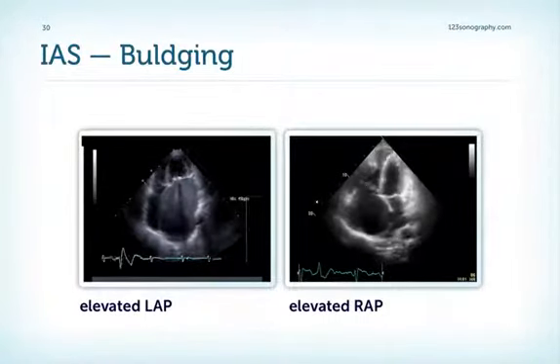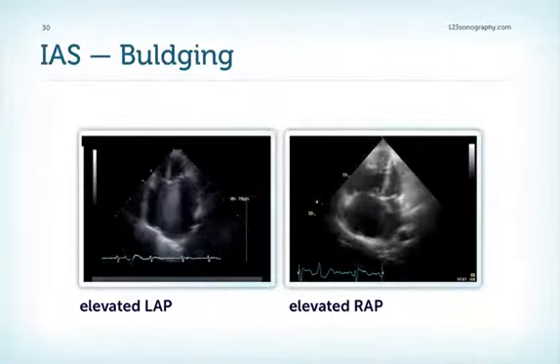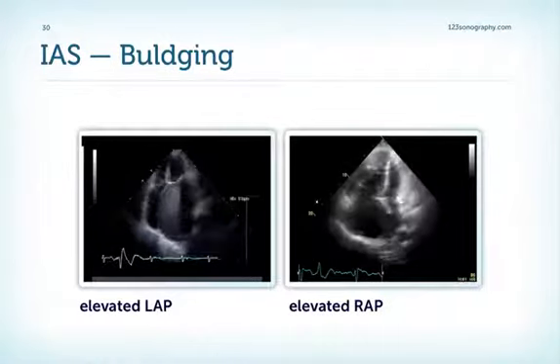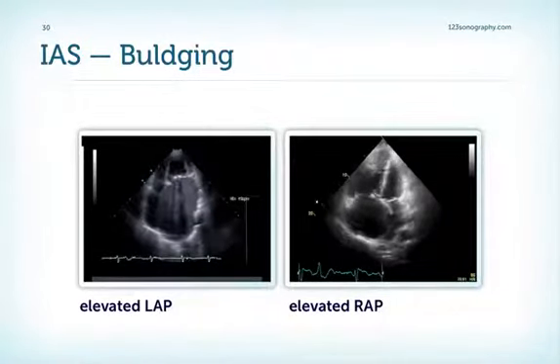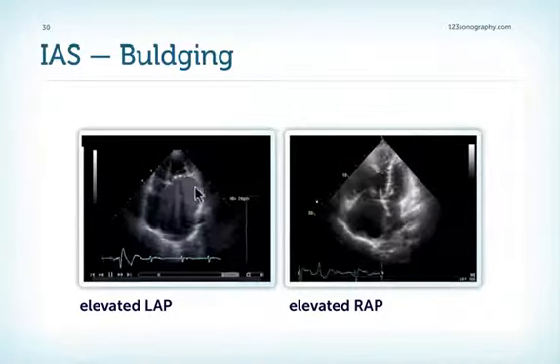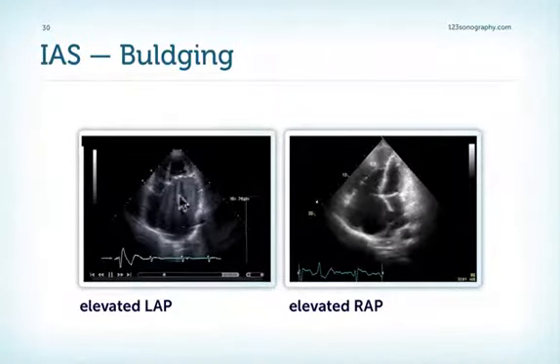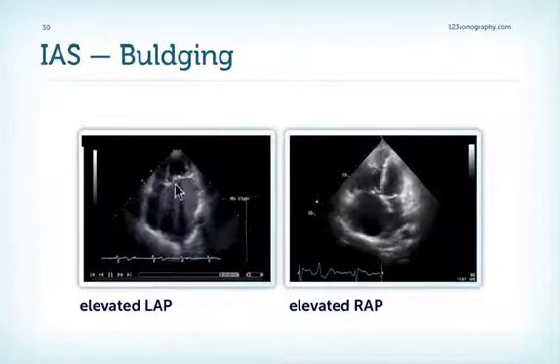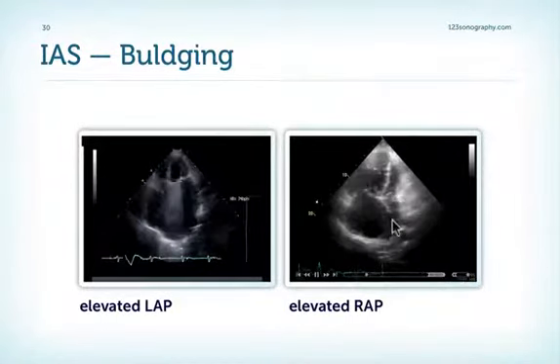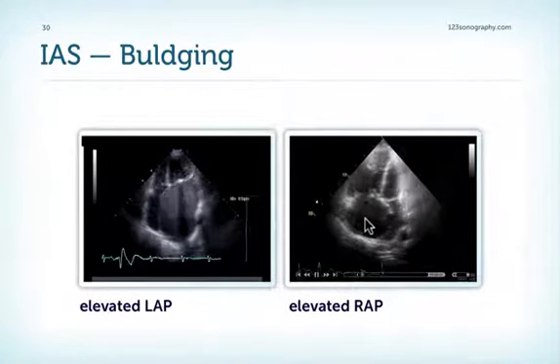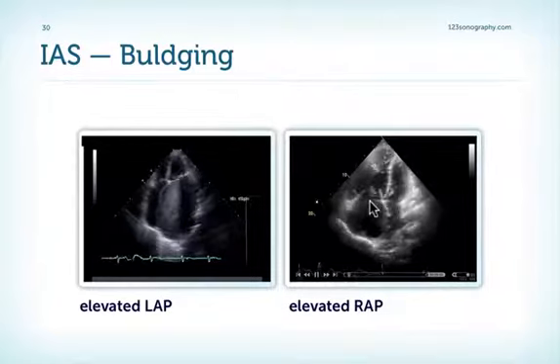An important additional finding is the position of the interatrial septum. If the interatrial septum bulges to the right, this is indicative of elevated left atrial pressure — as seen in this patient with rheumatic mitral stenosis. If it bulges to the left, it is indicative of elevated right atrial pressure — as in this patient with pulmonary hypertension.